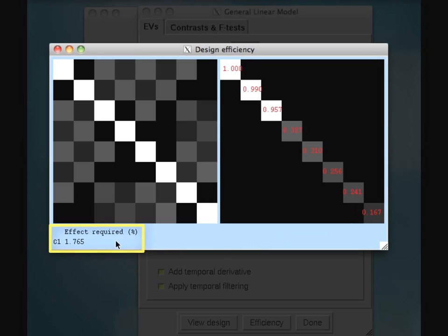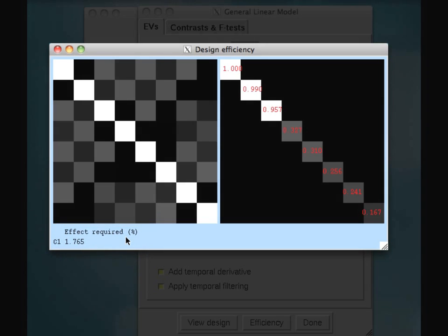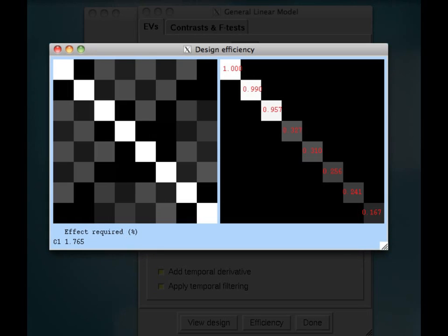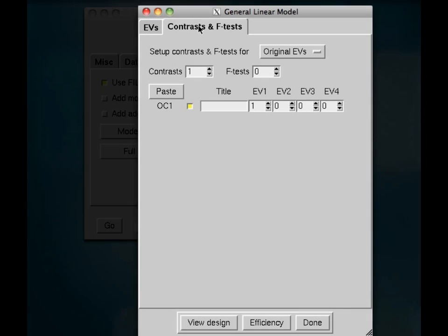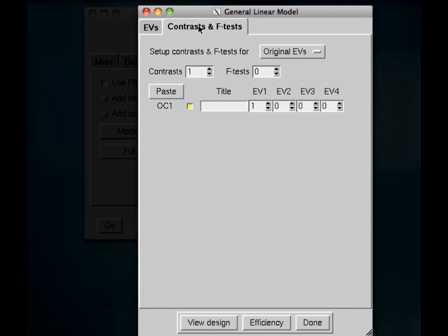And this other box over here represents the efficiency in estimating each of these regressors. Now, if any of these boxes on the diagonal are very, very dark or black, that means that you might have an issue. And lastly, when we start setting up our contrasts, it'll tell you what kind of effect is required in terms of percent signal change to obtain an effect which will pass your threshold that you specify, which we will also talk about later. So that's all been set up, and it looks good. So we're going to go ahead to contrasts and F-tests.